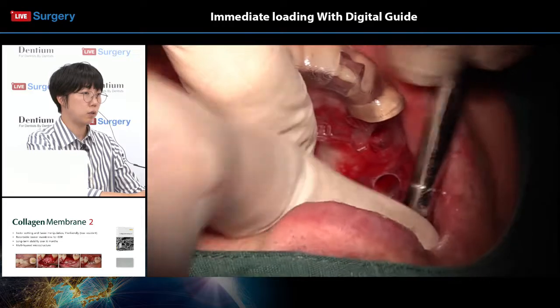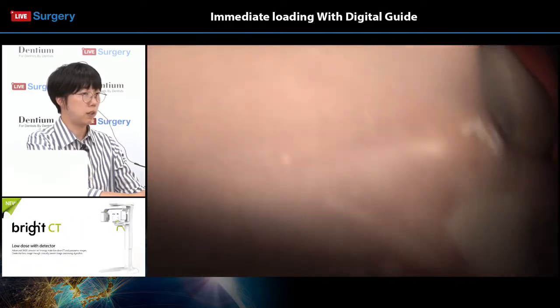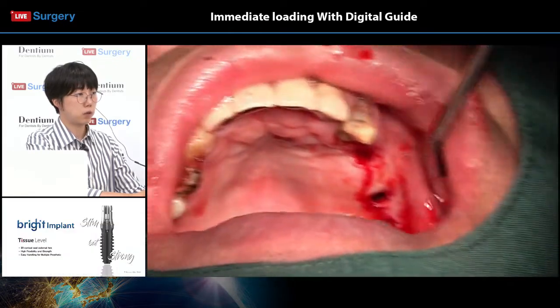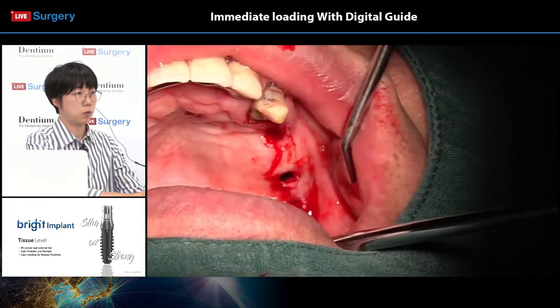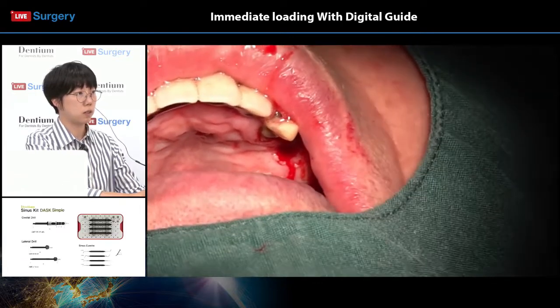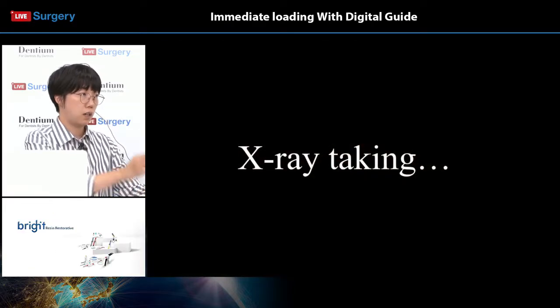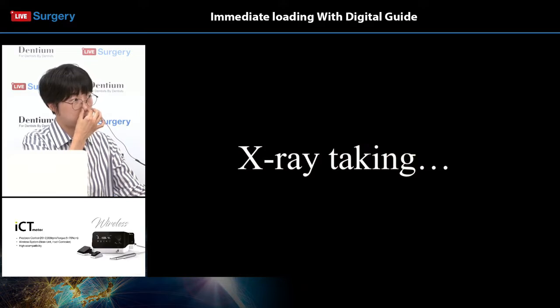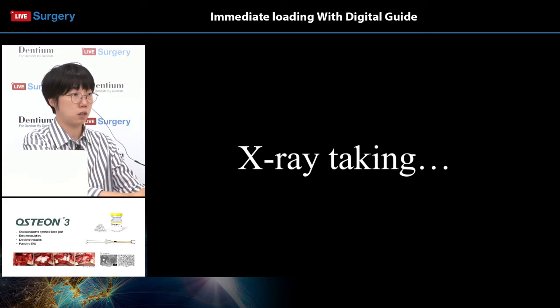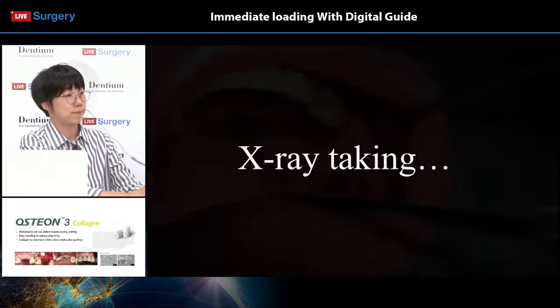I think tooth number 27 area has enough initial stability, but if the other parts don't, then Dr. Lee won't take the adventure to do the immediate loading in these areas. Okay, Dr. Lee has got to take another x-ray on the upper left area, so we will be taking another short break before returning to our surgery.